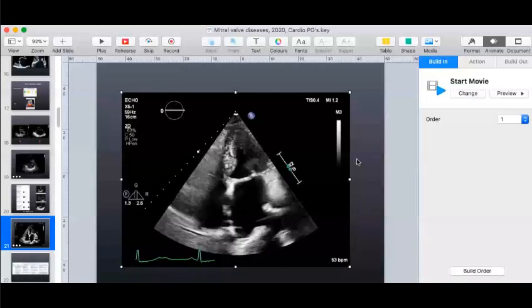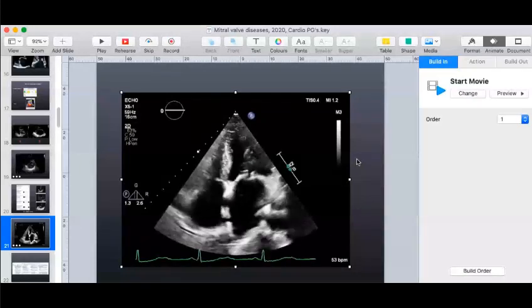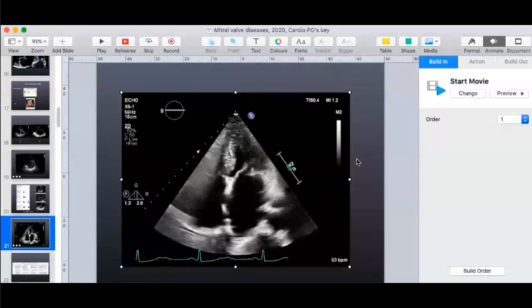There is a thickening of the anterior mitral leaflet and posterior mitral leaflet with an immobile posterior mitral leaflet. Okay. And there is a thickening of the subvalvular apparatus. Before that, let's start with the thickening itself.